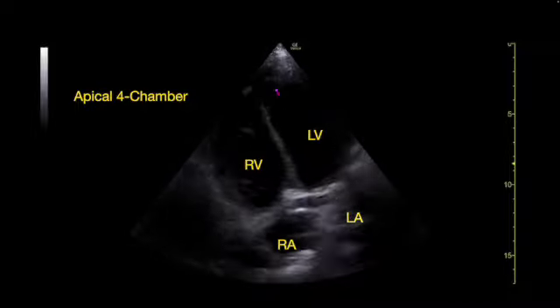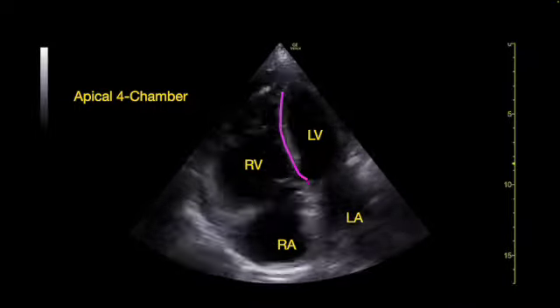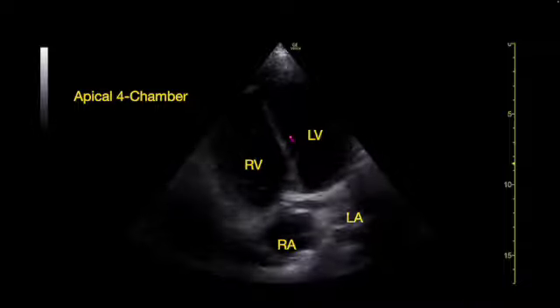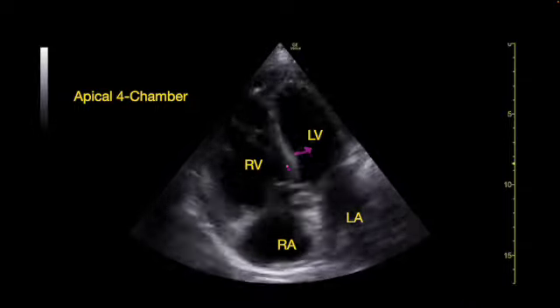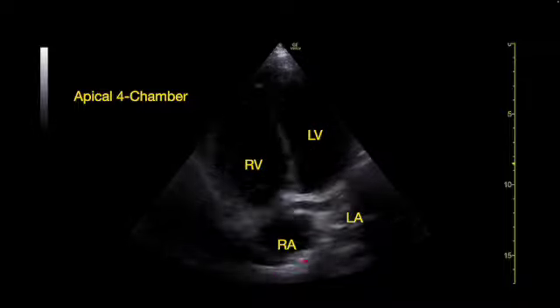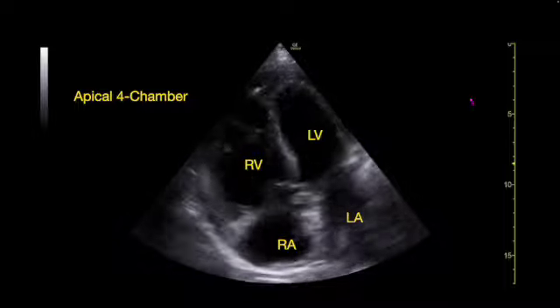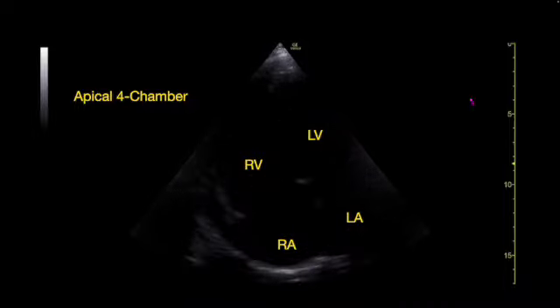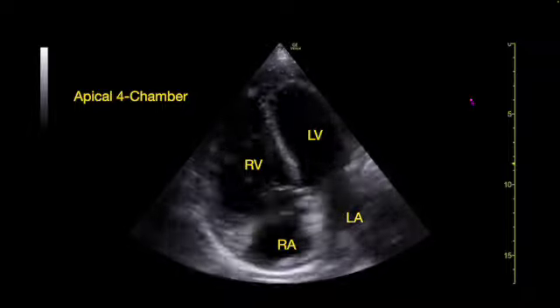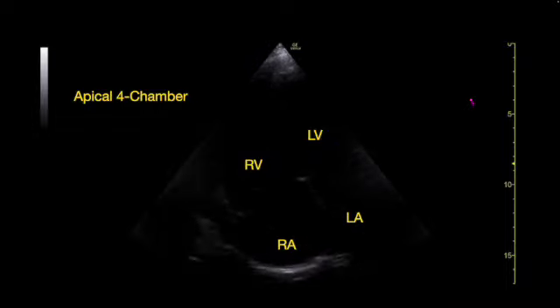And look at the septum. It's flat. Usually it has a little curve, right? The septum's flat, maybe even bowing into the left side of the heart. Definitely abnormal, all right? Indicative of elevated right-sided heart pressures. If we had a previous echo, I would absolutely look at it, make sure that this is not a previous finding. But let's just say in this individual, she had no right-sided heart dysfunction prior.